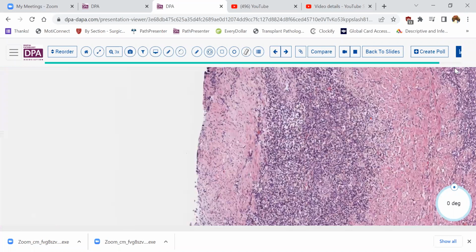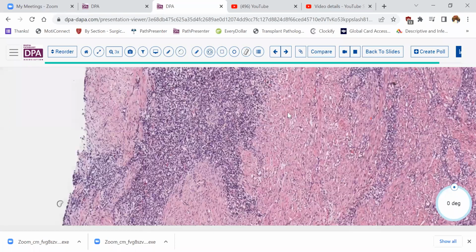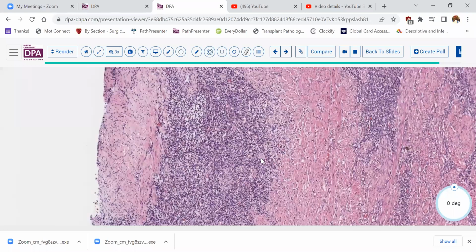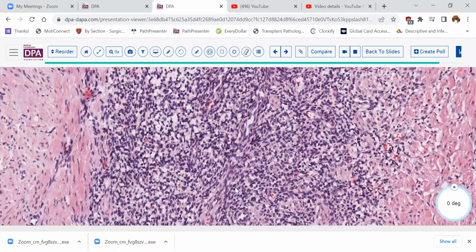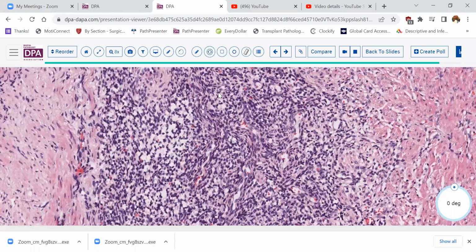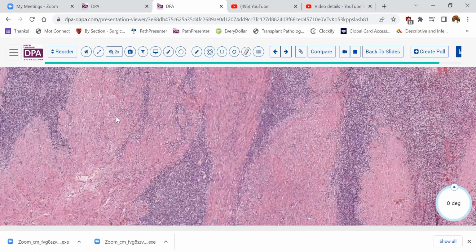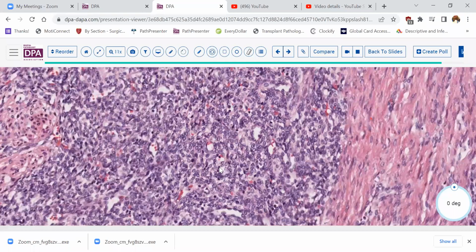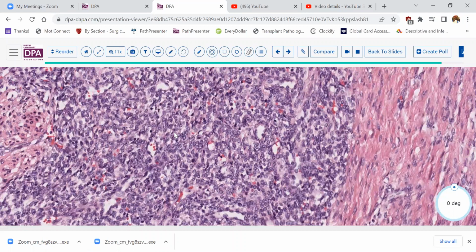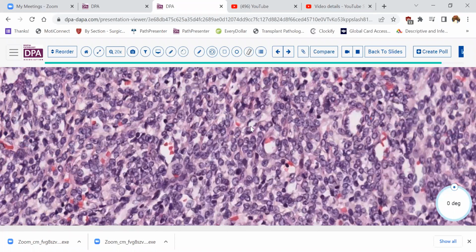This patient was a fairly young patient, and the lesion was confined to the uterus with just a very small amount of extension into the parametria. And so it appeared to be presenting as an endometrial stromal sarcoma would, in a very confined manner. Of interest in this case, the tumor cells were positive with CD10, and they were negative with BCOR, which is a consideration with endometrial tumors where you're wondering about high-grade lesions.